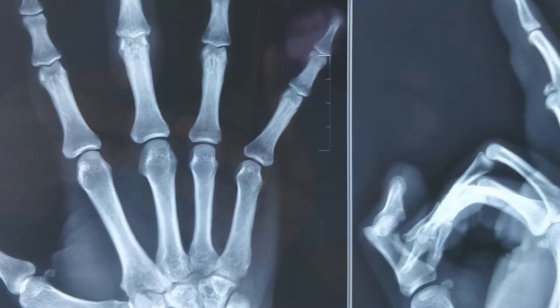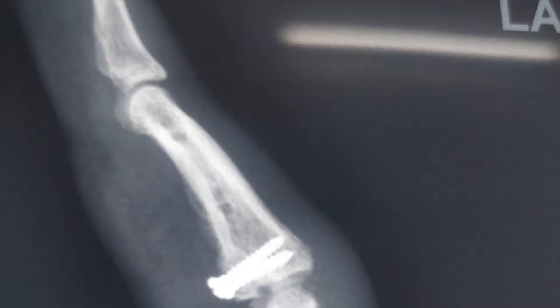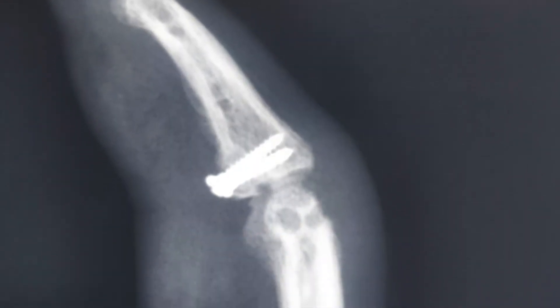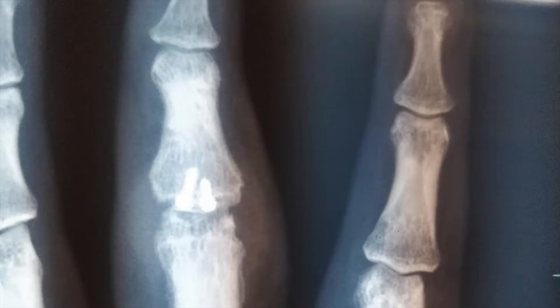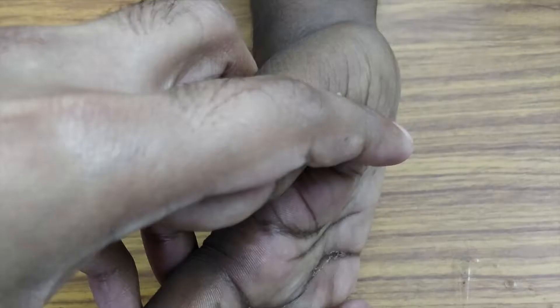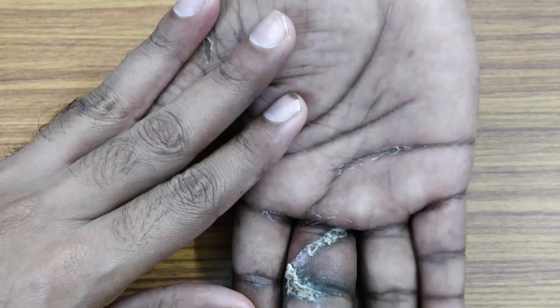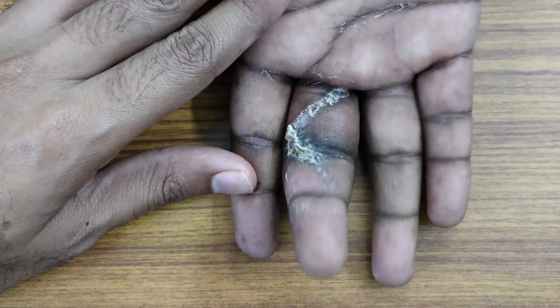As you can see in this image, this joint is damaged with dislocation of the middle phalanx posteriorly. This is the immediate post-op picture in which you can see that we have used a hammate graft from the wrist to fix it with a couple of screws. This is the immediate post-op range of motion.